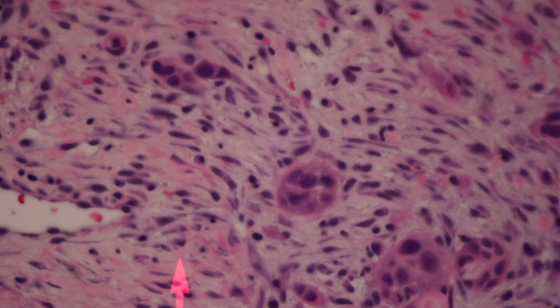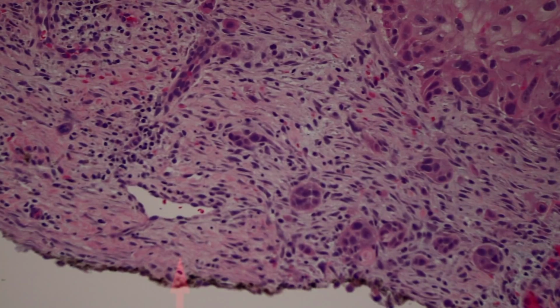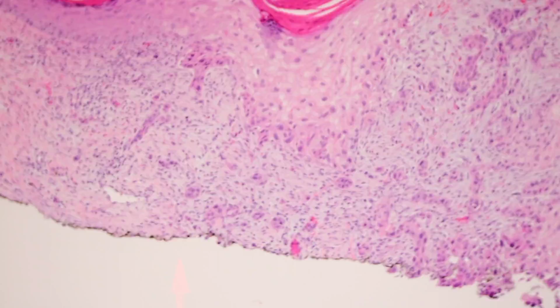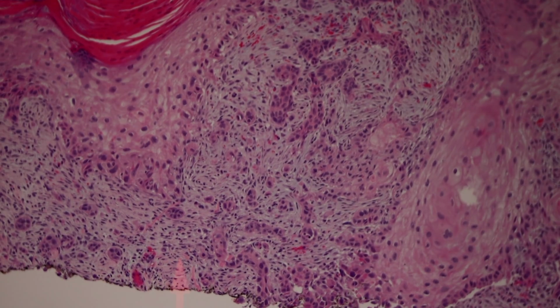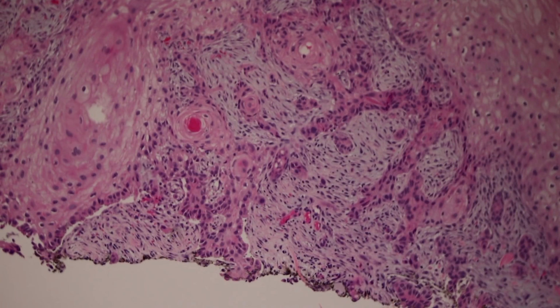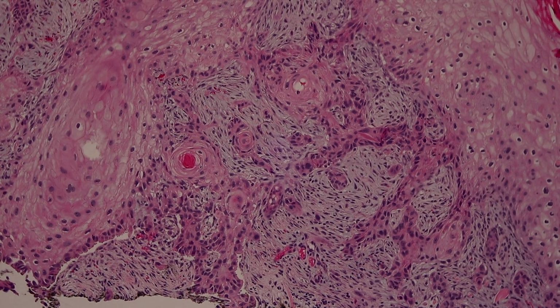So I think it's worth bringing up when I see this, and I call it squamous cell carcinoma, invasive, infiltrative growth pattern, just to let anyone who's treating it know that this tumor is very infiltrative. I don't have a definitive line where I decide if something's infiltrative or not. Just like with basal cell carcinoma, it is a bit subjective, but if I notice it and think, wow, that's really infiltrative, I usually feel like it's worth bringing up so that my clinical colleagues will know about it and can take that into account when they're deciding about treatment. And then usually I do not give a differentiation for squamous cell carcinoma.